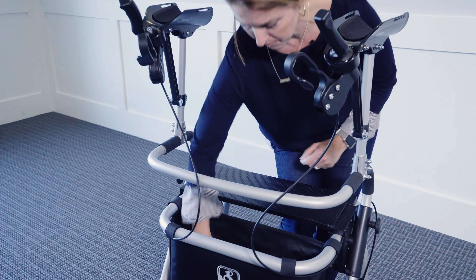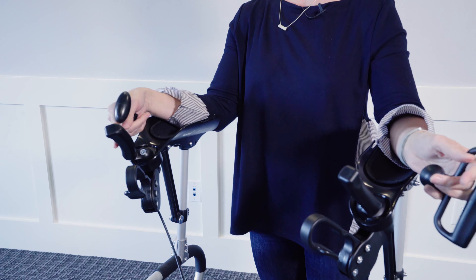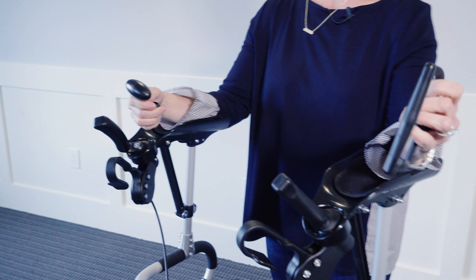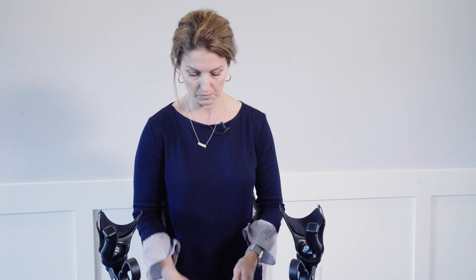It comes standard with these three styles of hand grips. This is the typical one that most people would use, but it also has the knob grip, and then another grip version. Sometimes you could use one grip for one hand and another for the other hand, because on a hemiparetic patient you might need a different grip for each hand.